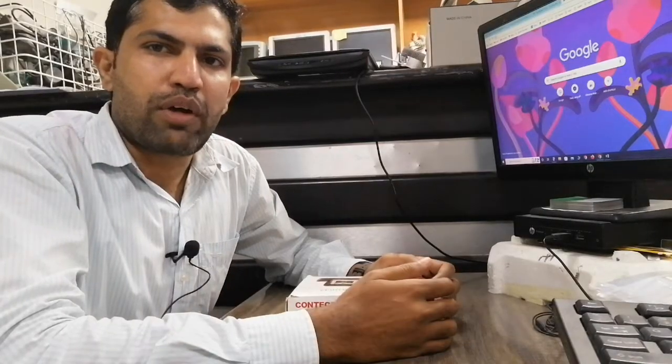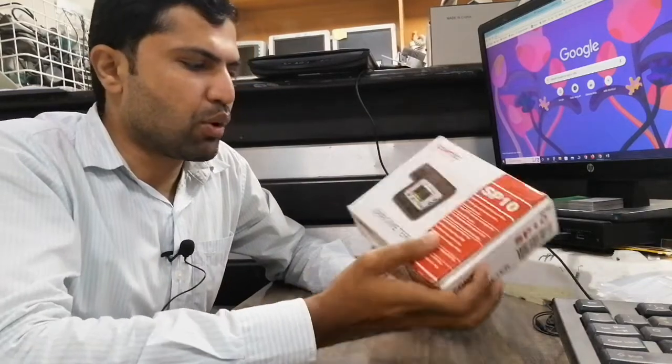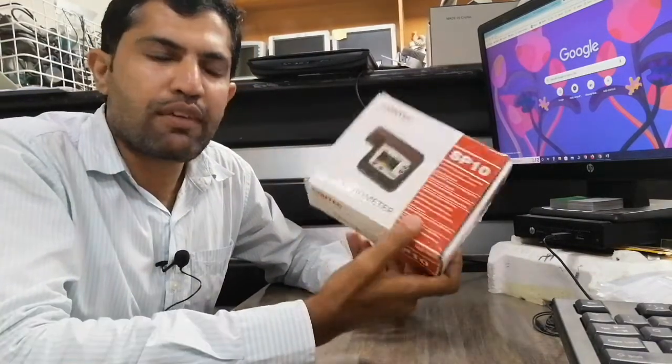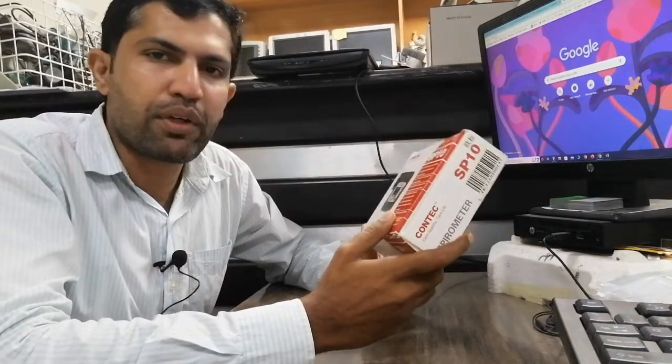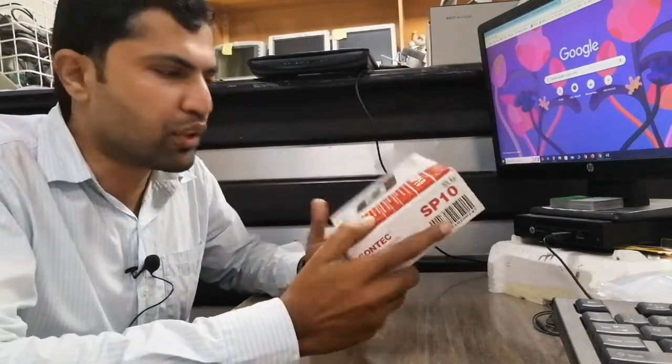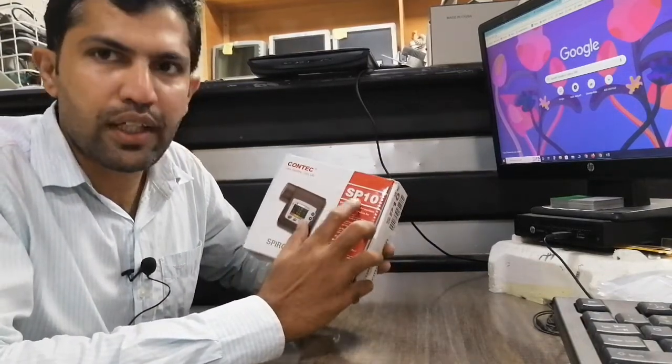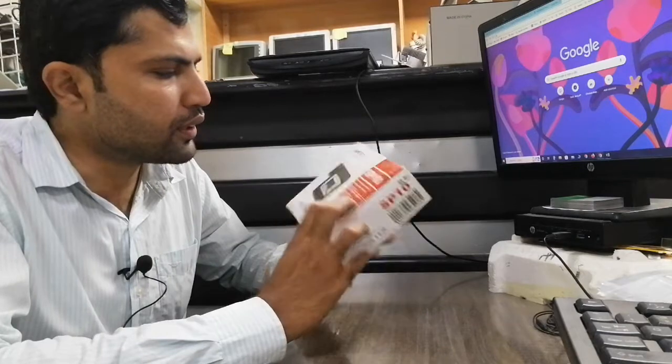Hello guys, my name is Adeel and you are watching the Biomed Dude. Today I will discuss the spirometry — this is a portable spirometry machine. In this video I will discuss the parameters of this spirometry and then show you how to use it. This is the Contec Medical spirometry machine, model SP10.